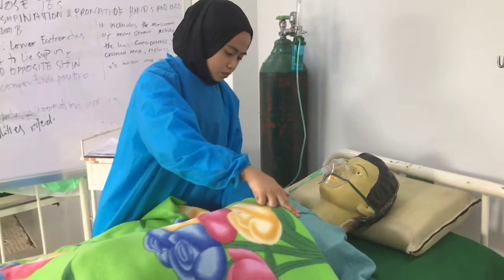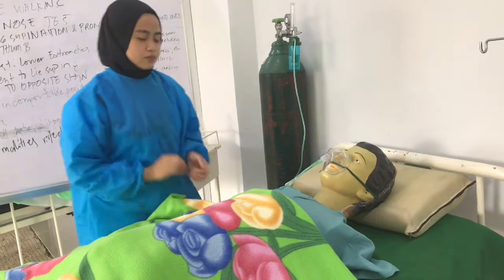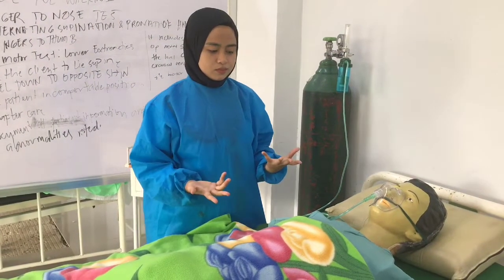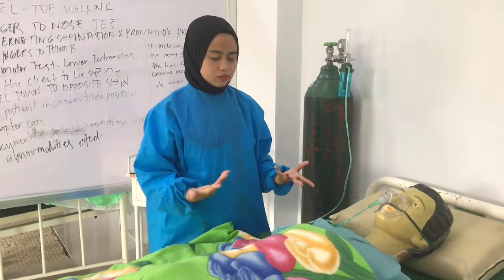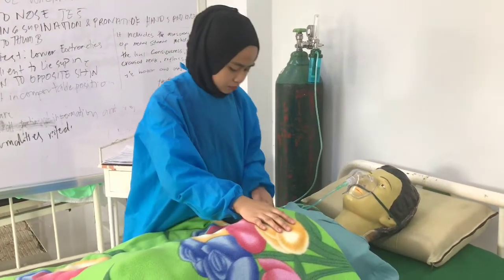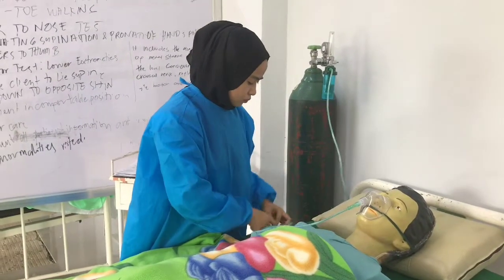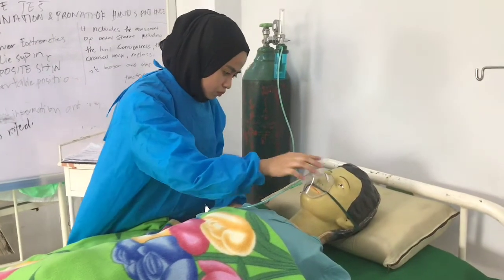Assess the client's vital signs, level of anxiety, color, and ease of respirations. This is to check client's response from the oxygenation. Assess the client in 15 to 30 minutes depending on the client's condition and regularly thereafter for clinical signs of hypoxia, tachycardia, confusion, dyspnea, restlessness, and cyanosis. Review oxygen saturation and arterial blood gas results if available. This is to ensure doing the right procedure and to find any deviations.